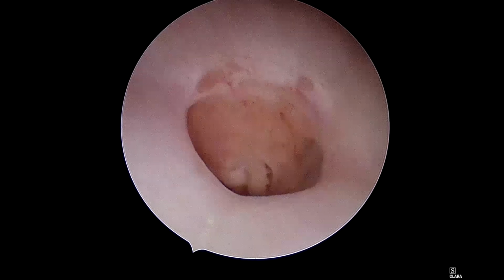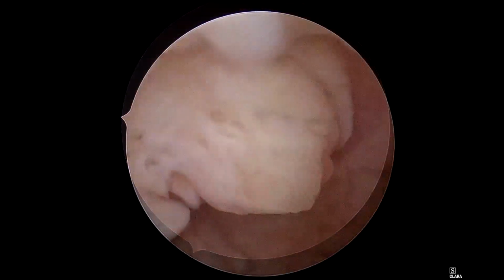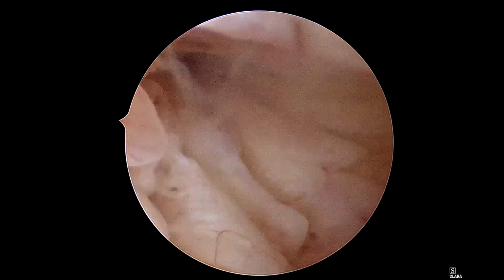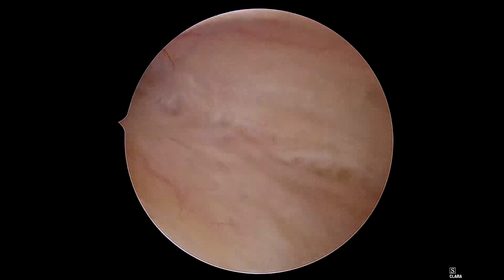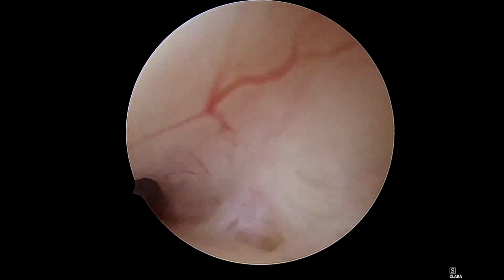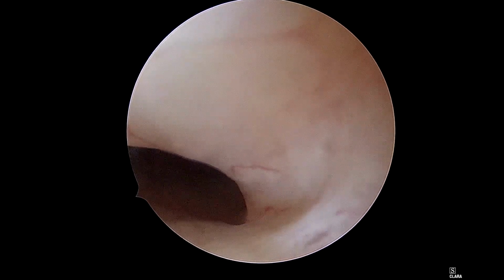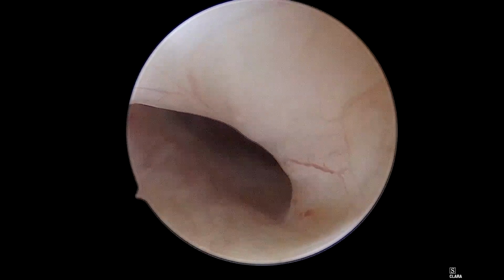The case was just a simple myoma resection in an old patient, 68 years old, with postmenopausal bleeding. The demonstration was one of the workshops in a country. Here we start by going through the cervix, demonstrating the characters of the endocervical mucosa, and I was explaining how to enter the uterine cavity, the oval-shaped internal os, and glide on the anterior wall, gently and easy.